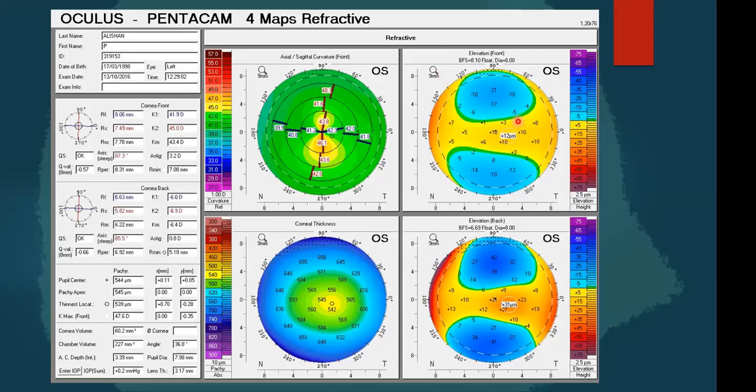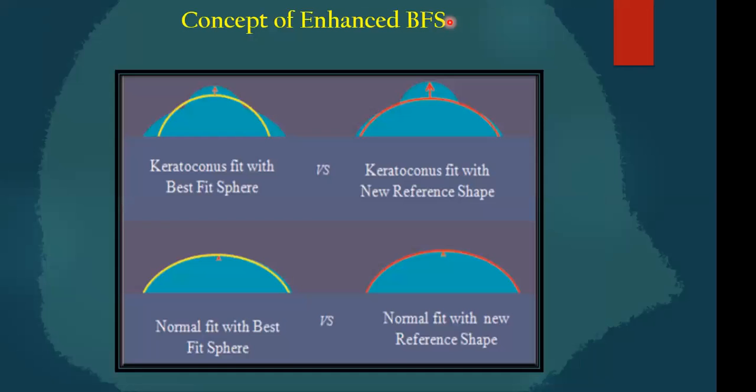Okay. Anything else that you would like me to tell you? Yeah, there is one more question, like how do you identify a post-refractive cornea on topography? And is it possible to know which refractive surgery has been performed? Yes, sure, I will show you this.